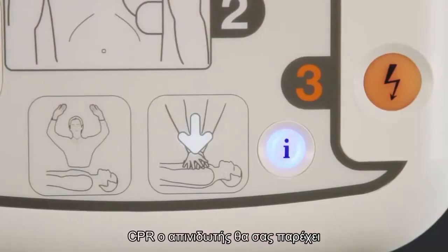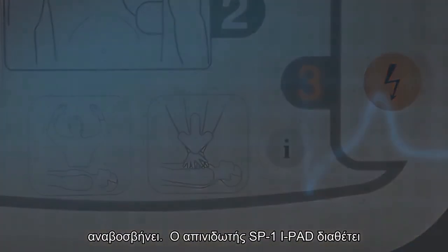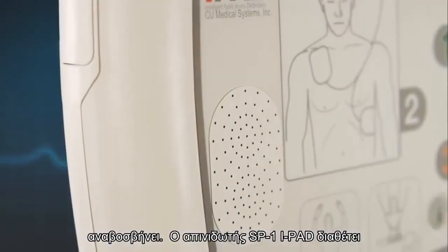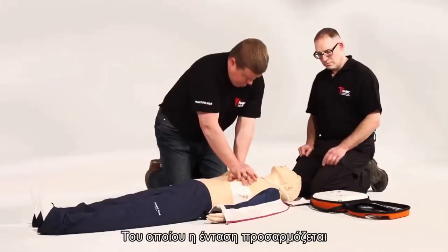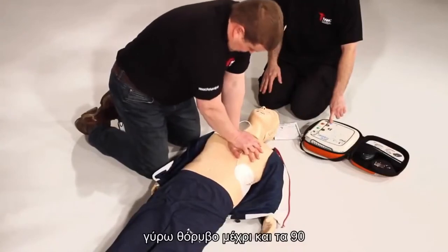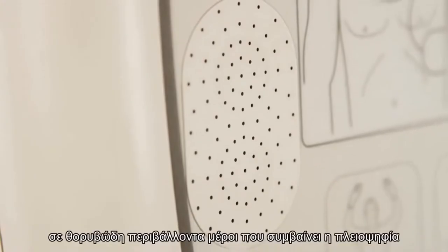Once again, the AED will say 'For help with CPR, press the flashing blue I button.' This AED features a unique built-in ambient noise detector. This will automatically adjust the volume of the AED depending on the surrounding noise, to a maximum of 90 decibels. This is particularly useful in noisy environments.